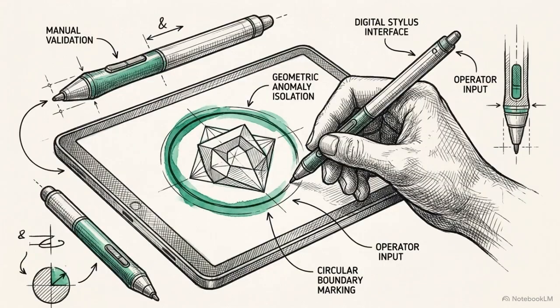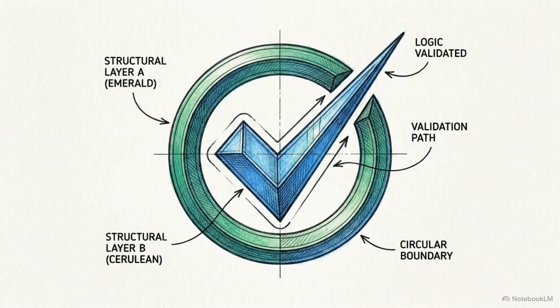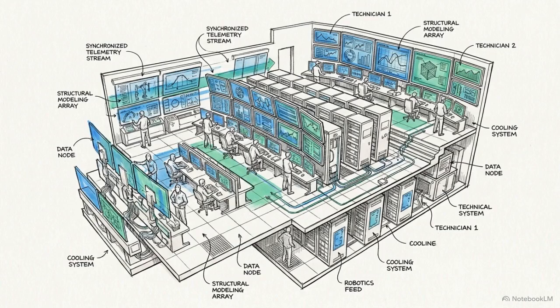The final requirement is human-in-the-loop validation. Expert surgeons manually review and annotate the specific edge cases that cause the statistical alert, confirming whether the model's new logic aligns with clinical reality. By linking these systems together, a hospital guarantees that no recalibrated math ever touches a patient without explicit, parallel-tested verification.